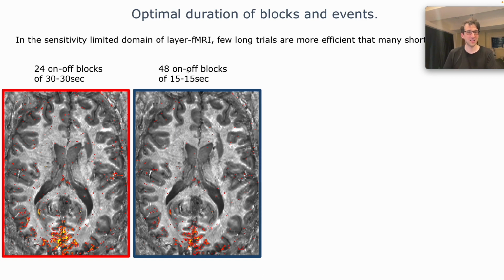Then I looked at it and I figured, well, I have double the number of samples now, even though they are shorter. It must be the same, but in fact it isn't if you look at the z-scores, right? So here we have a nice line of voxels following the cortical ribbon. Here we just have it scattered, right? Something's going on. All the values are certainly weaker. I need about double the time to get to the same significant z-scores as those ones.